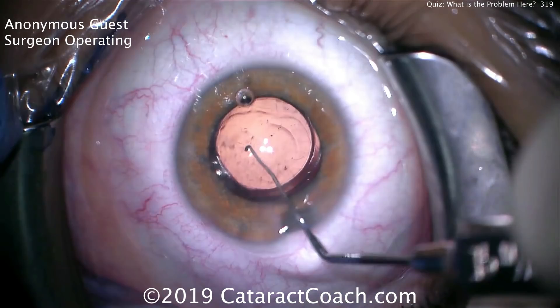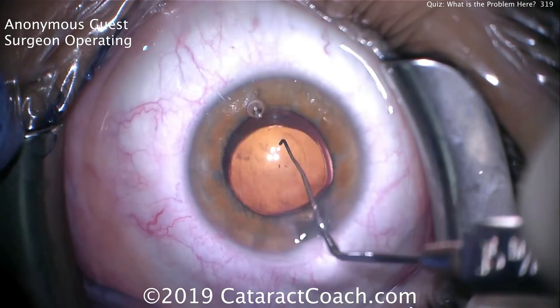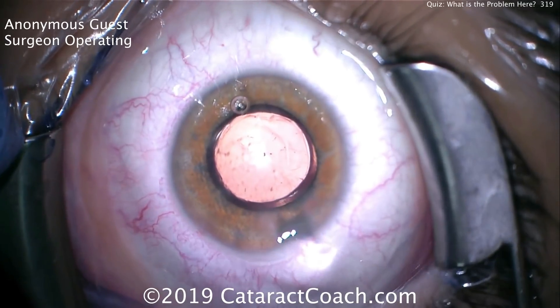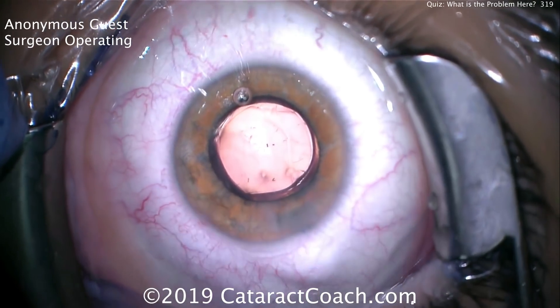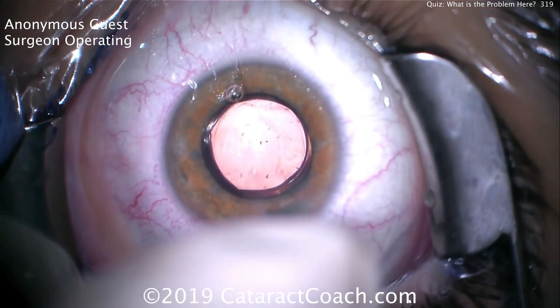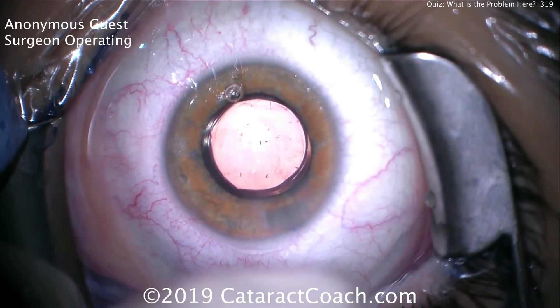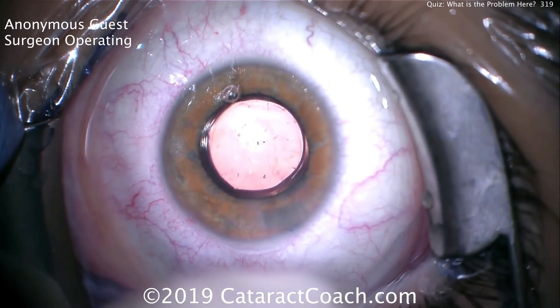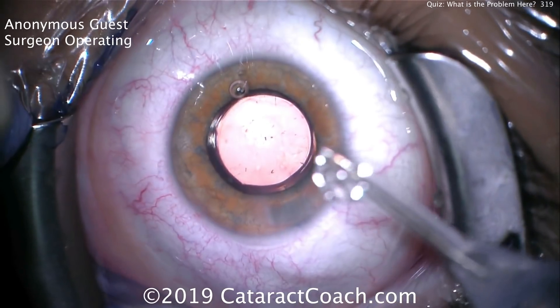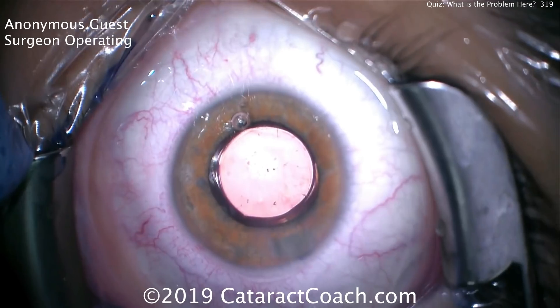What are the options here? If you realize the lens is upside down as you're injecting it, you can flip the injector around. If it's in the eye already upside down like this, we can actually flip it in the eye — filling the eye with more viscoelastic, grab it, get it out of the capsular bag, flip it to the correct orientation, and roll it inside the eye. Be careful not to scrape the corneal endothelium or damage the capsular bag.